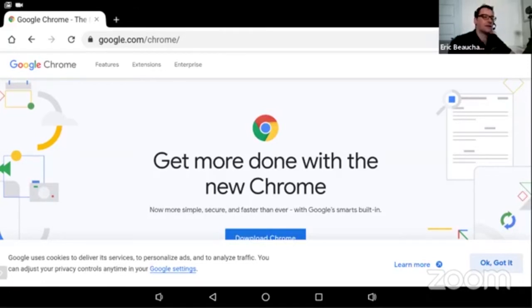On the Matt Connect, you won't have access to the apps, because on the Matt Connect you already have a similar way of doing things with the APH Toolbox. Maybe I can get my Matt Connect and show you how to get the same kind of feature. Inside the APH Toolbox, tap on that big APH icon in the carousel, and in the settings you can show all apps that are installed. You can either install them on the APH Toolbox and add them to the list, or just access them very quickly.